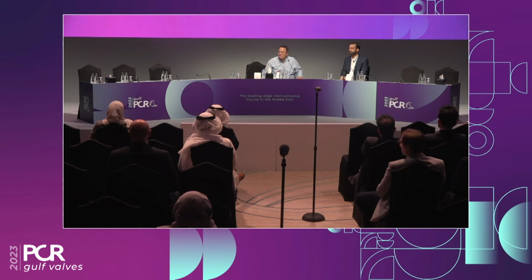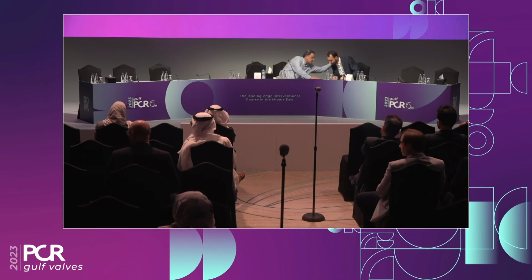What do you think, Faisal? The balloon expandable valve guy. I'm no platform guy, I'm an evidence-based guy. But I just want to say that the demonstration of the case is excellent, and I want to make sure that for the operator who wants to dive into a new platform, we take a message about the Accurate or the Navitor now, that you want to use it in a horizontal aorta. Is there any other thing that you would like to reach for the Navitor as a platform? What are the patient characteristics that are going to make you say this is a perfect case for a Navitor? Okay, thank you.